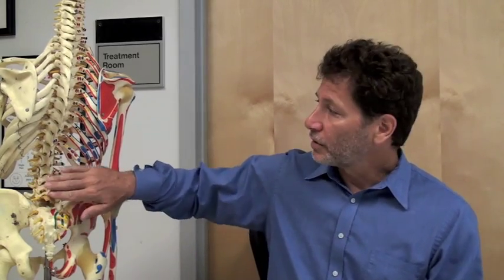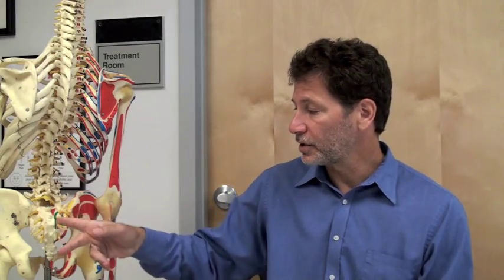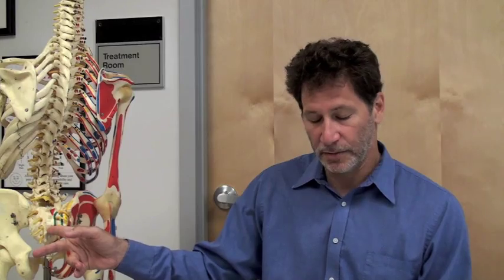Today we're going to be talking about a very common procedure we do here in the pain clinic called a caudal epidural. That's C-A-U-D-A-L. And caudal refers to an anatomic location. We have the lumbar position, we have the cephalad position, meaning towards the head, and we have the caudad position, meaning towards the feet. In this instance, we'll be placing the needle from below into the epidural space.